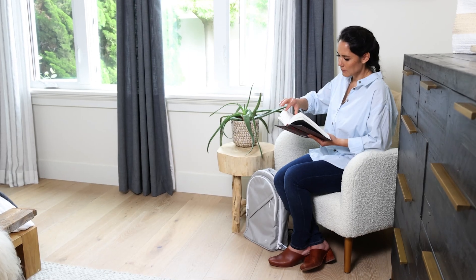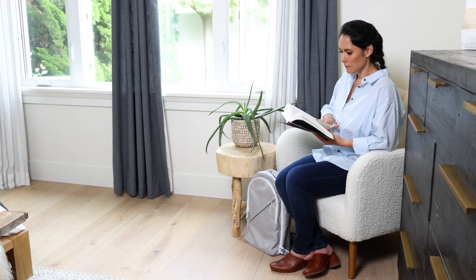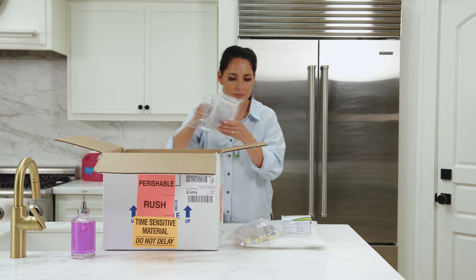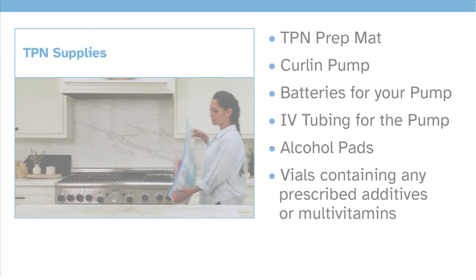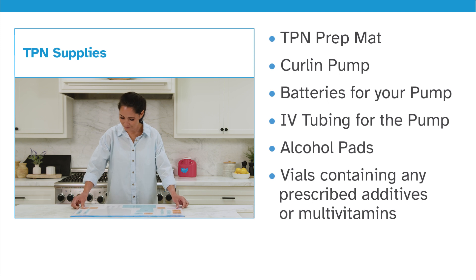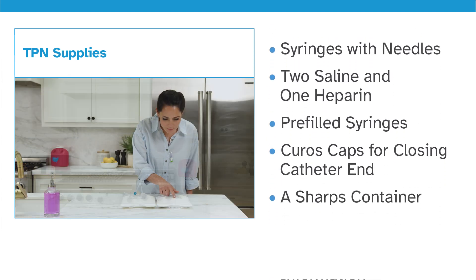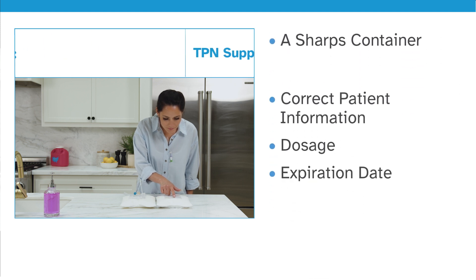In this video we will show you how to prepare and administer TPN at home. First, gather your TPN supplies on a clean surface. Here is a list of everything you are going to need. Use your TPN preparation mat to help stay organized. Check your TPN bag and labels to make sure your name is on it and that the other information listed is correct.